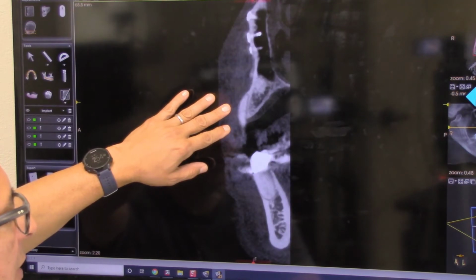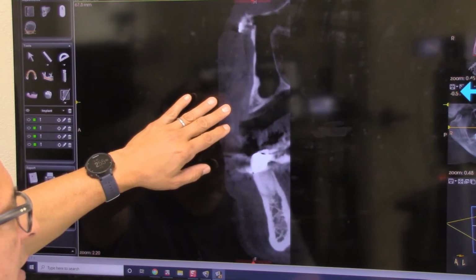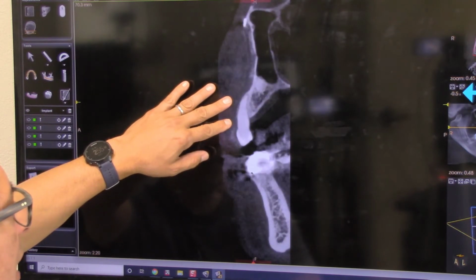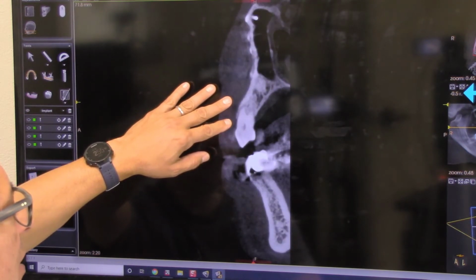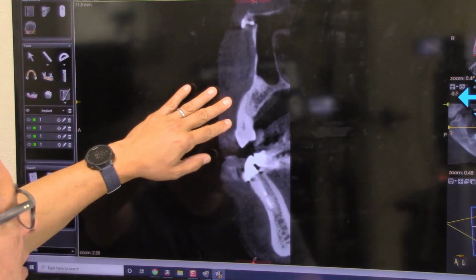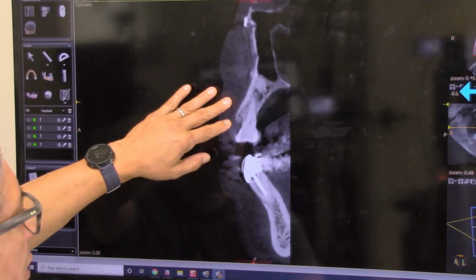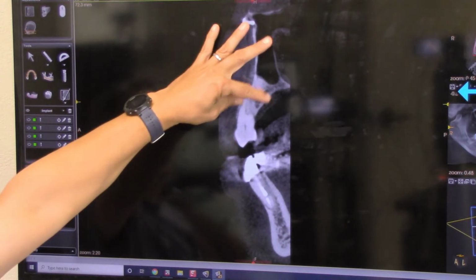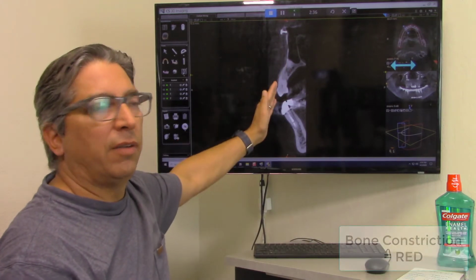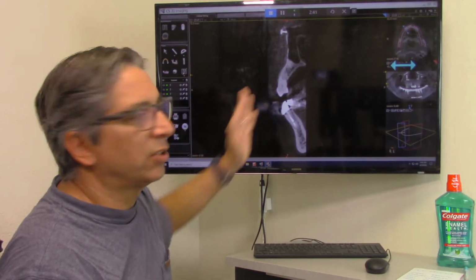And it's very, very difficult. How do we deal with this? The other problem she has is the anatomy here, how much it actually angles out. I'm trying to get right across the tooth, but you can see this is a really weird geography. It still goes into my constriction ideas about how that bone is. So it's a very tight constriction coming through here. The bone is coming into this curved way. Very difficult when you're trying to put an implant in and still get the teeth in the same position, and then there's not really much bone there.